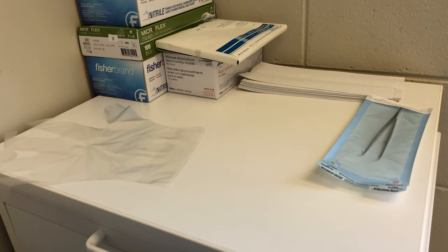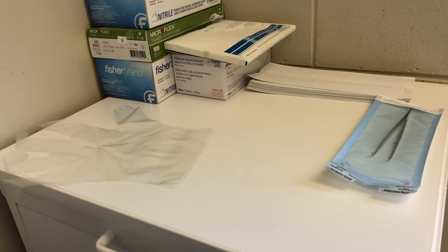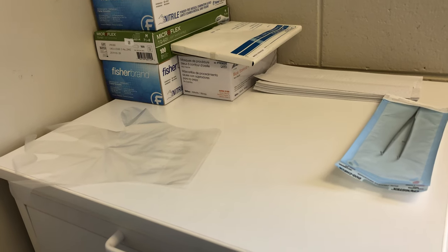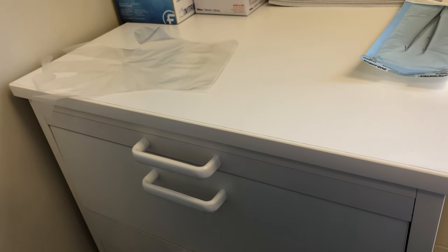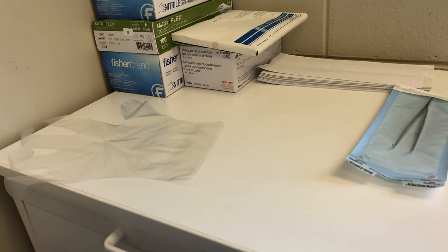This video is going to demonstrate aseptic retrieval technique for the dental assistant. Aseptic retrieval means we are going into a central supply area — whether it's a drawer, a supply tub, or a multi-use package — without contaminating it.